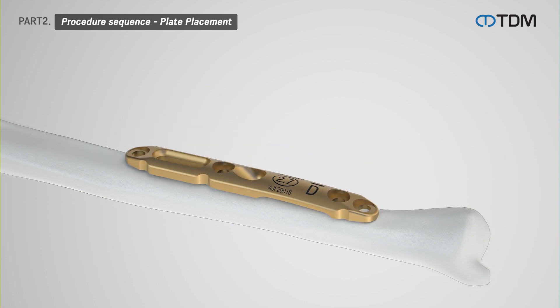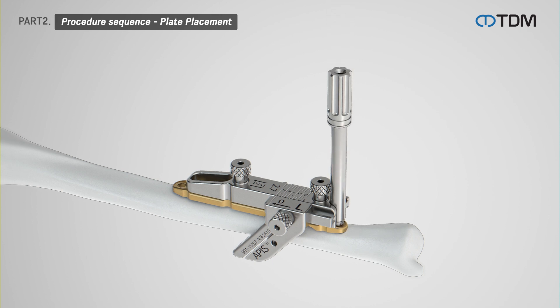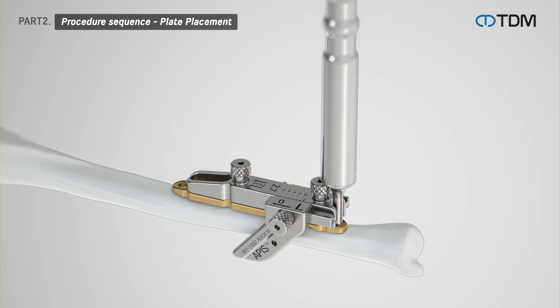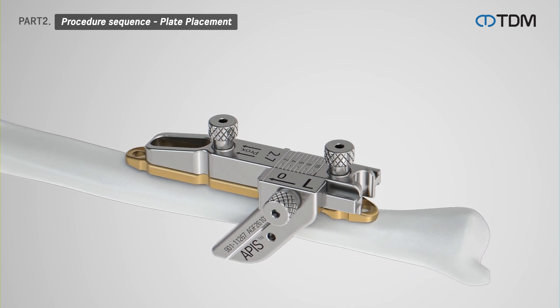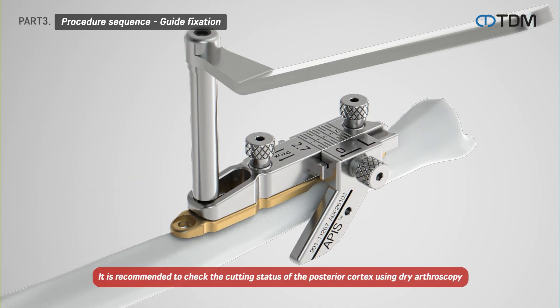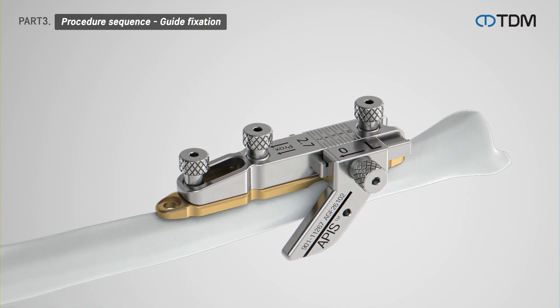Select the appropriate sized plate and position it on the bone. Distinguish between left and right surgeries and fix the cutting guide to the plate with screws. Next, drill using a locking drill sleeve. Measure the insertion depth with a depth gauge and then secure the plate using screws. Drill at the proximal end of the guide using the drill sleeve and drill bit. Insert positioning screws into the plate and firmly secure them to the cutting guide using a screwdriver.